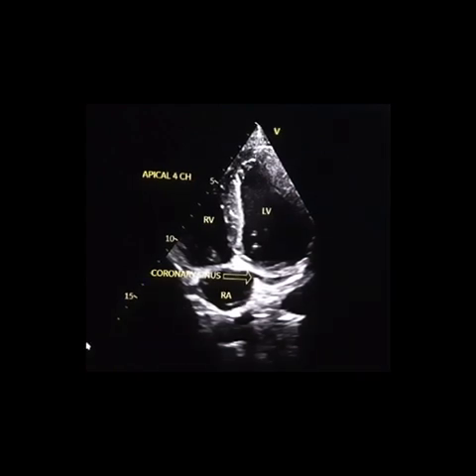Let us examine the coronary sinus in the apical view. It's a little bit tricky. From true apical view, you may not be able to see the coronary sinus unless you tilt the transducer towards the posterior wall of the left ventricle. Then you can see beautifully running coronary sinus, and directly it is draining inside the right atrium.